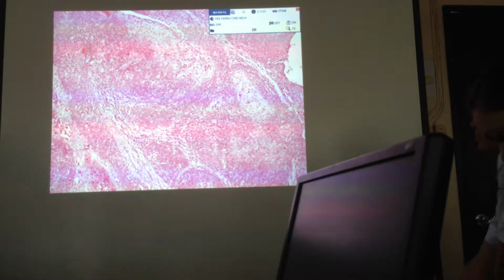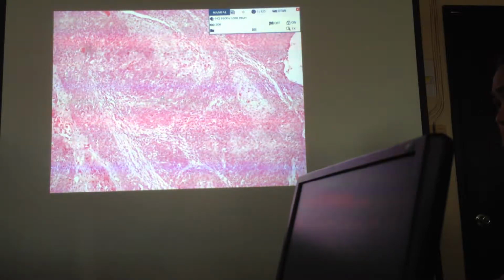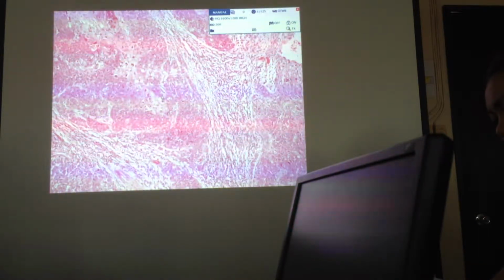Okay, yun sa highlighted. So, large cell carcinoma, these are the ones that are linked to this large cell carcinoma. Small cell carcinoma, if you remember the small cell carcinoma of the lung, that's the appearance wherein you have the nuclear molding. That would be a feature for small cell carcinomas. Okay.